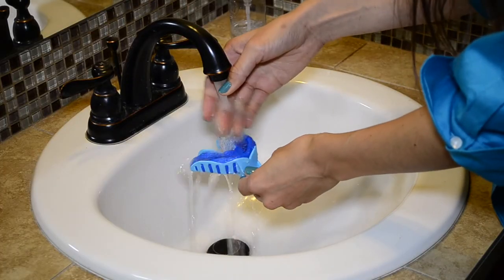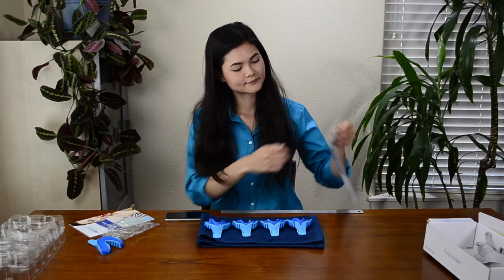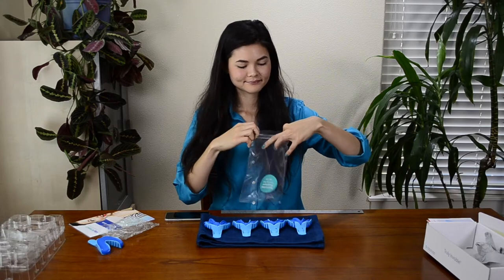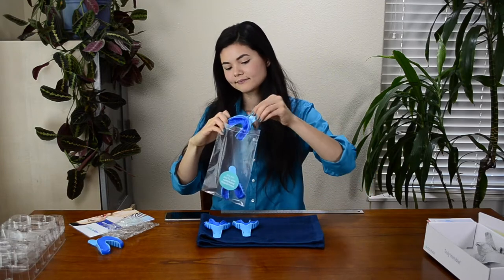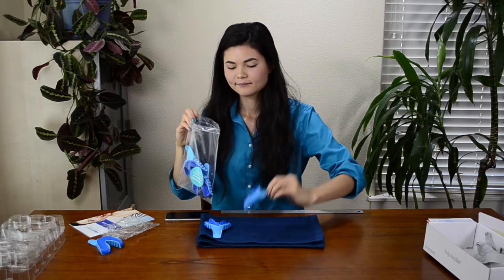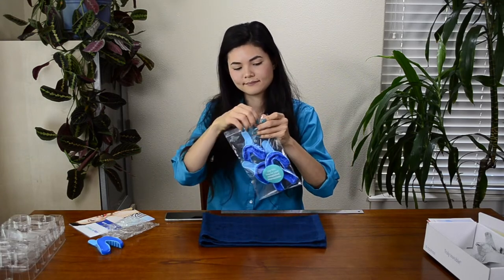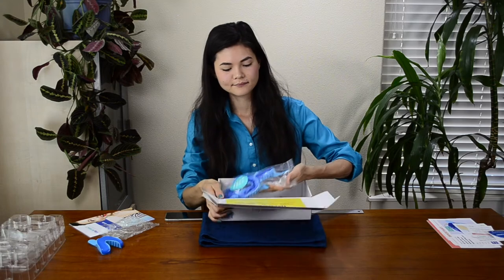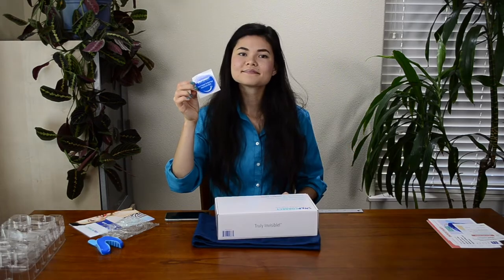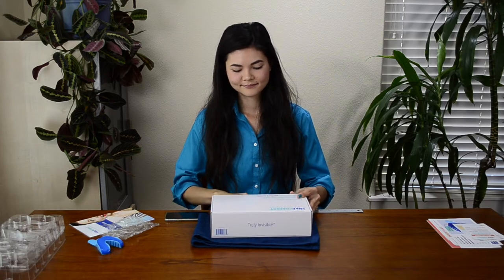Now that you have four finished impressions, rinse all four in cold water and let them air dry. Place the four dried impressions into the sealable bag provided in your SnapCorrect impression kit. Please do not attempt to remove your impressions from the tray, as this will make your impressions unusable. Be sure to properly seal the plastic bag. Next, place the bag in the impression kit box and seal the box using the blue sticker provided in the impression kit. The kit comes with a prepaid USPS shipping label on the bottom of the box — just drop it off in the mail.